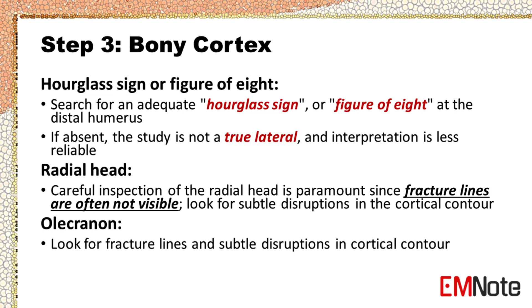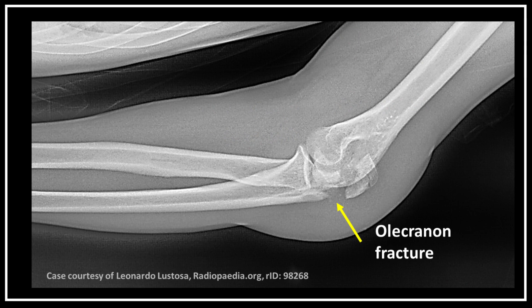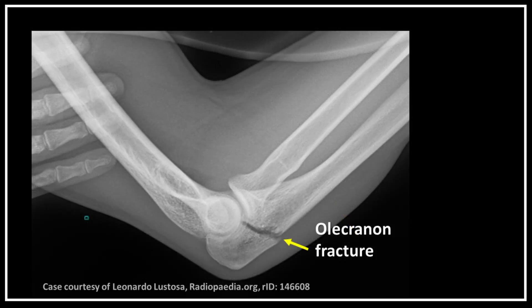Look for fracture lines and subtle disruptions in cortical contour, especially the coronoid process and the olecranon. An olecranon fracture is a break in the bony tip of the elbow, which is part of the ulna, and is usually caused by a direct blow to the elbow or from landing on the elbow.